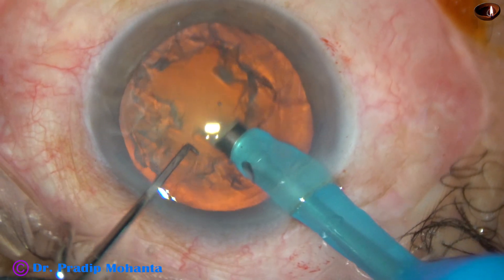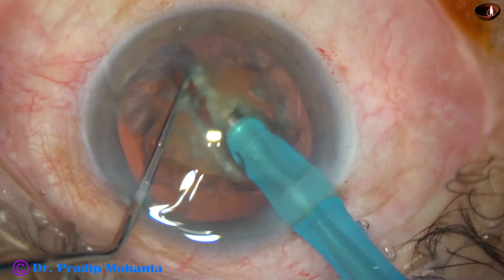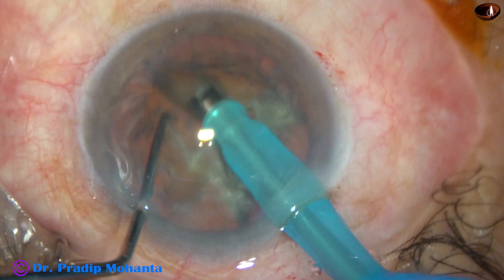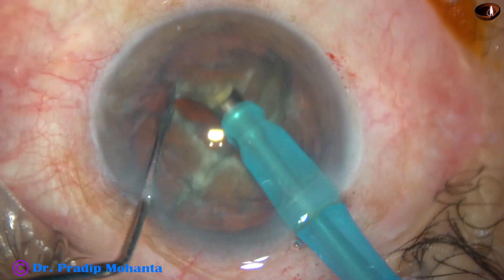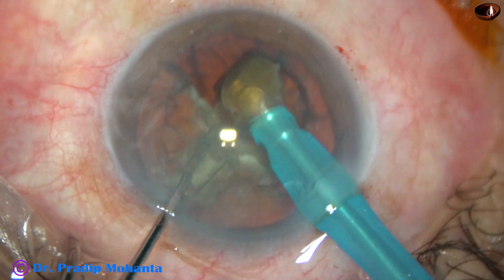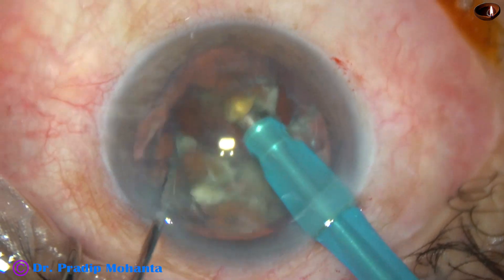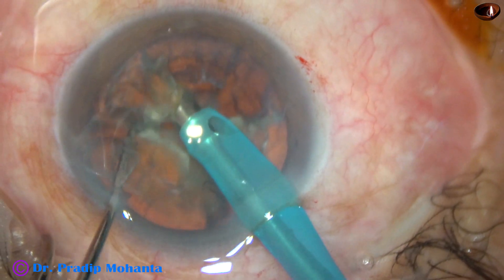Now watch direct chop. The tip is buried into the substance of the nucleus; the nucleus is held very firmly and the nucleus is chopped — the tip travels through the substance of the nucleus. The nucleus has been divided into four large fragments. Now each fragment is caught hold of with vacuum and further subdivided into two smaller pieces and emulsified.